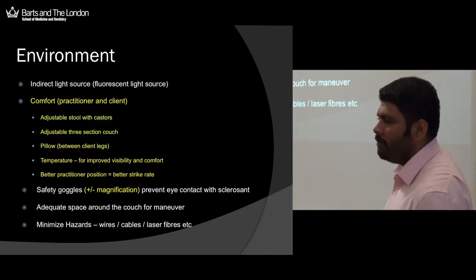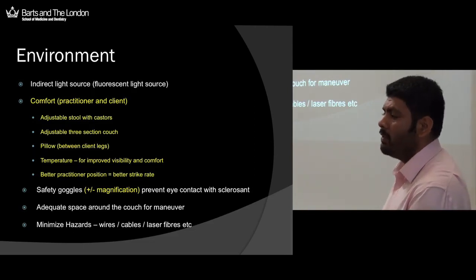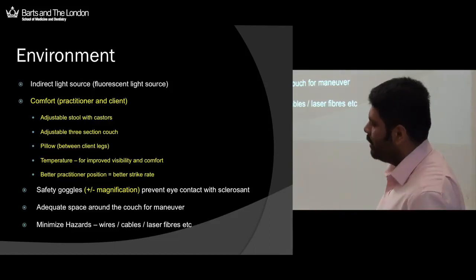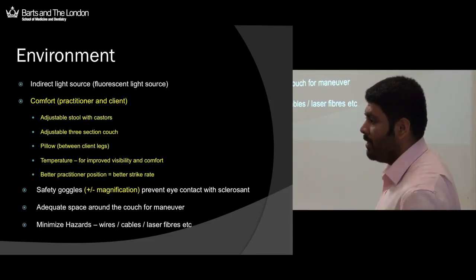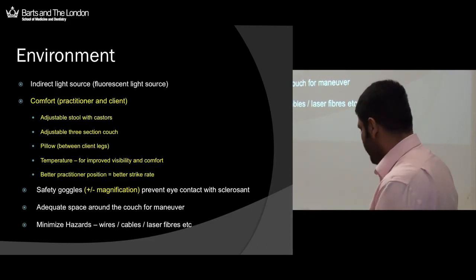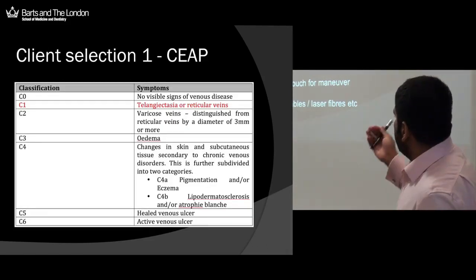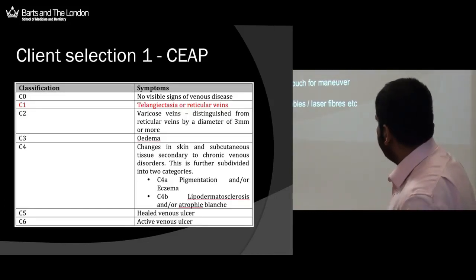Safety goggles: very often because of the superficial nature of the injection, the bevel of the needle is half out, so getting fluid going directly out of the bevel and almost inevitably hitting your eye is a problem in sclerotherapy. So always wear protective eyewear to protect from infectious hazards. And obviously, adequate couch space and adequate maneuverability around the couch as well.